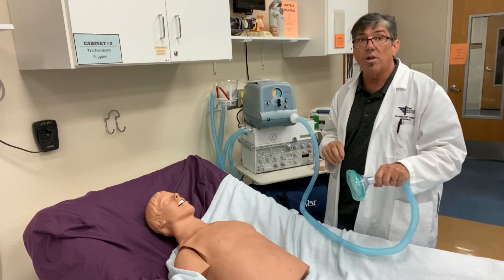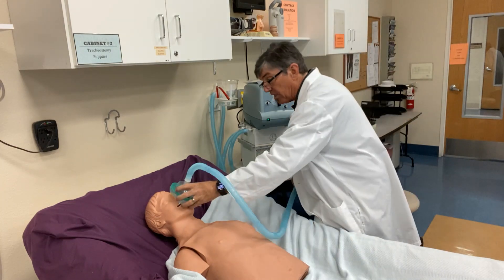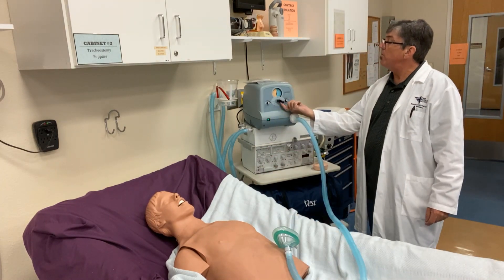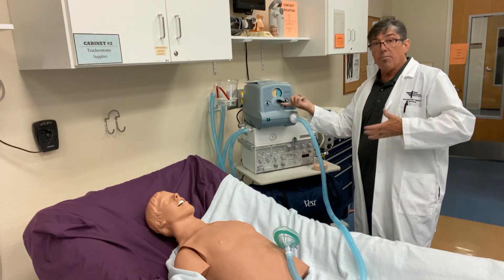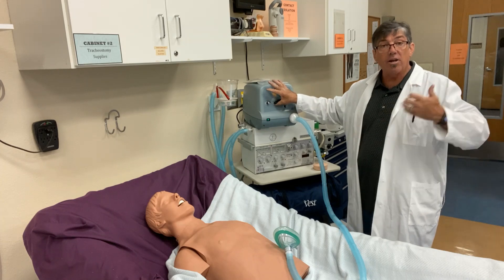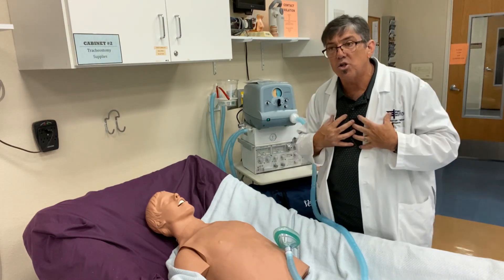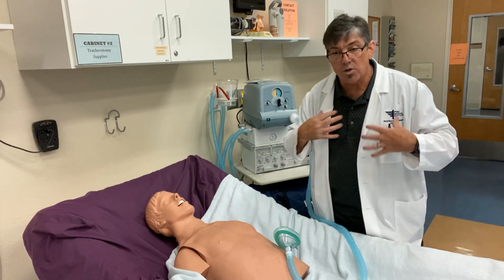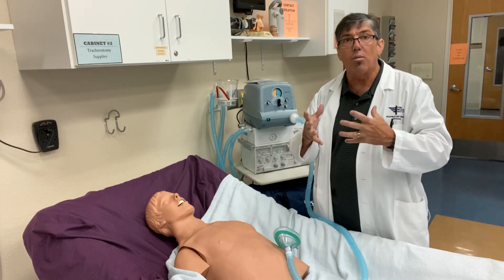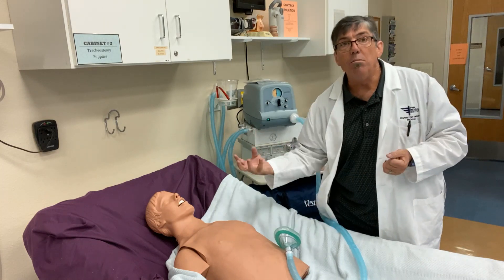So here are some basic controls. We're going to do some close-ups so you can see the actual controls and how we set those. Very simple procedure: place the mask on the patient's face, watch them breathe, encourage them to take a big breath. When they do, toggle the inspiratory switch to inspiratory — that will deliver your set pressure, giving them a really big breath — then over to exhalation, which helps pull the breath outward. Coming along with that will be secretions, and usually that cough will be stimulated. Now you can see with a patient that doesn't have good control or the ability to take big breaths, secretions can begin to cause atelectasis and problems in the lungs. This is the way we can expand the lungs by giving them a big breath, and by drawing back with negative pressure on exhalation, have the patient begin to move secretions upward.